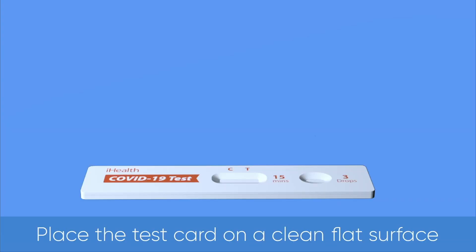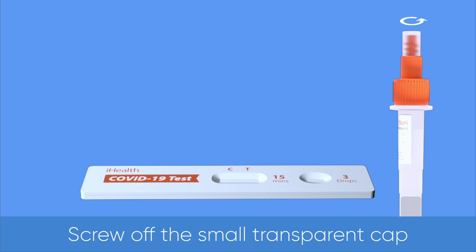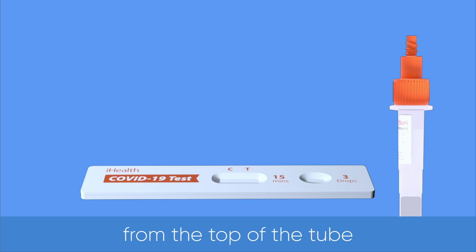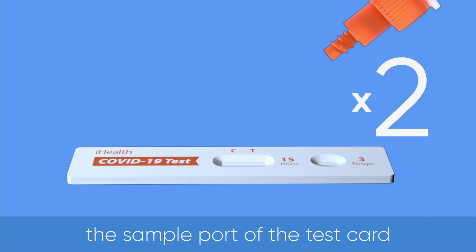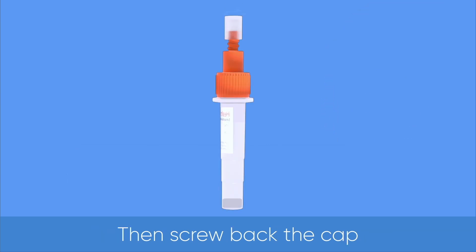Place the test card on a clean, flat surface. Screw off the small transparent cap from the top of the tube. Add three drops of sample into the sample port of the test card. Then screw back the cap.